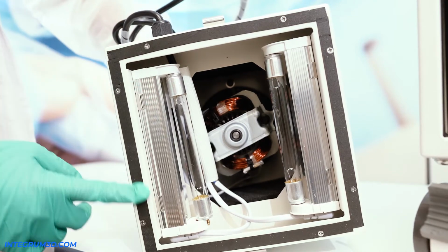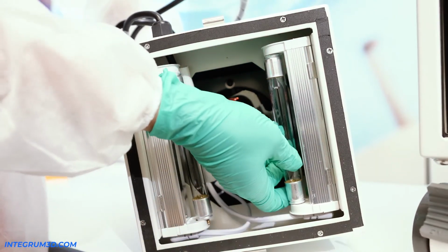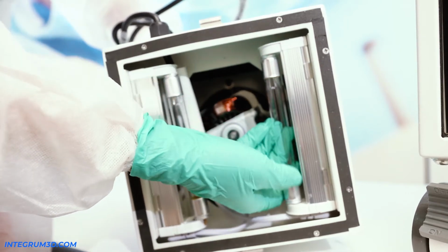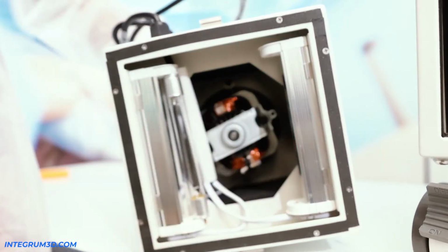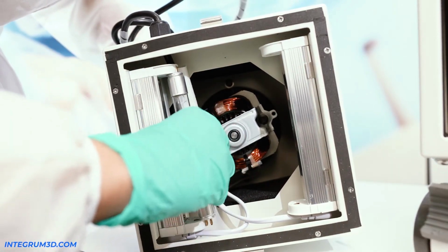Your UVC light bulbs are at the bottom of your machine here. You're going to turn them to the left away from you, and then you're going to pull them out. Turn this one this way, and then pull this one out.